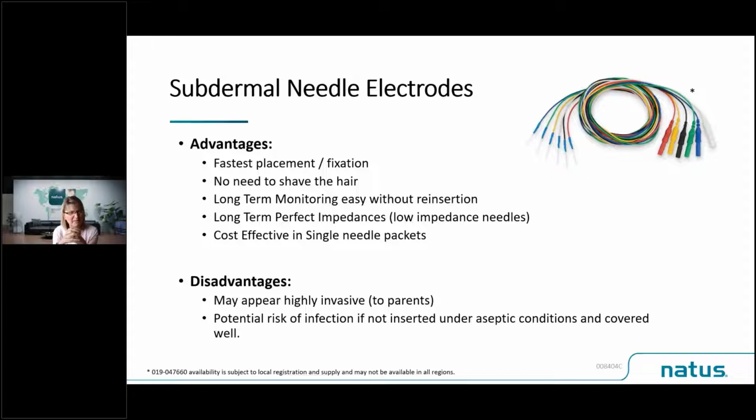Parents are worried about needles in their babies' heads. And obviously it is something that is breaking the skin barrier, so there is a potential risk of infection if they are not inserted under aseptic conditions and covered well. I can only tell you from experience of using needles for 10 plus years, I think I've seen one example of a very localized erythema on a needle. But if you clean the skin well and you cover them well, then there's a really low risk of localized infection.